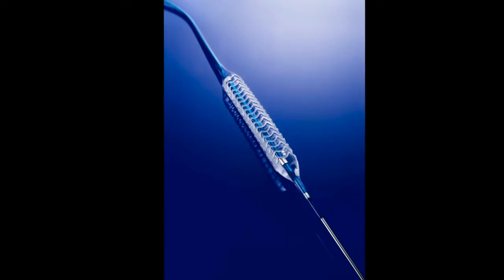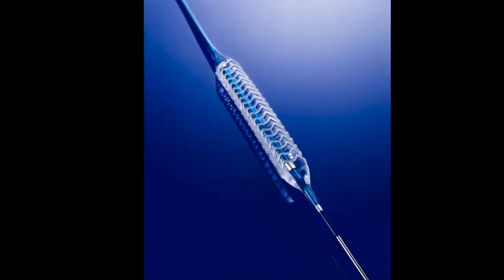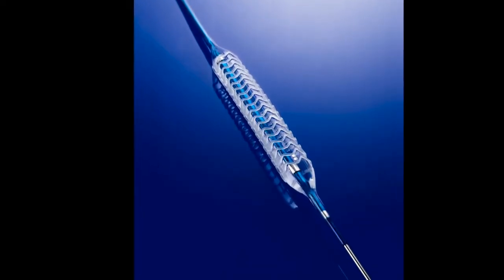And within the margins that you had, there was no significant statistical difference between the outcomes for these stents, slide by slide, when you went through those presentations. That margin was predefined in collaboration with the FDA, and I think also in agreement with the FDA document on non-inferiority trials. So we were conservative in the non-inferiority margin that was picked. I know some critics said that with the BVS, the Absorb stent, there were slightly higher numbers, not statistically significant because of the numbers and the power of this trial. But if you were to trend that out, there might have been some sort of a signal if you had more patients.